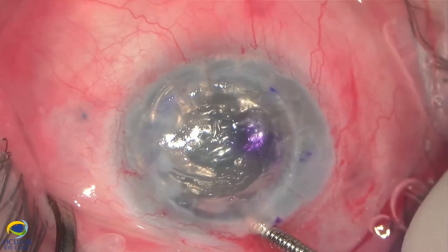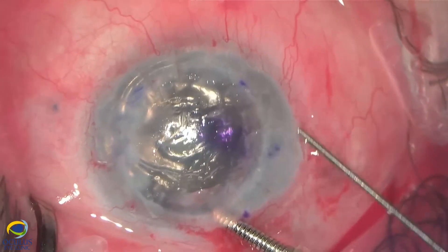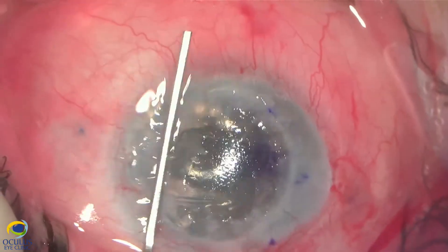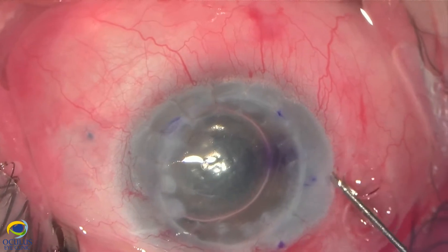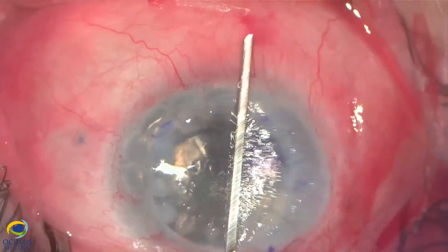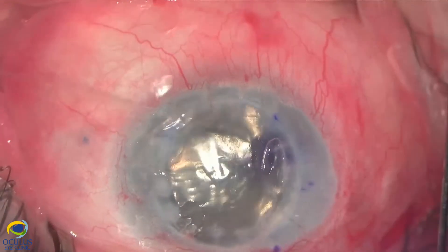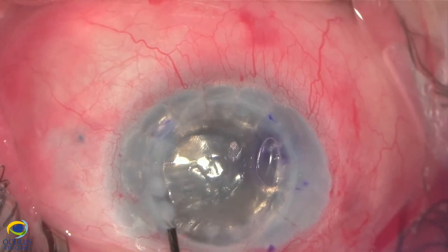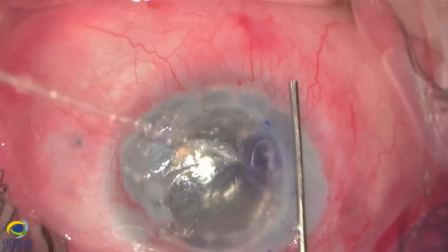In cases like this, it is quite difficult to see the margins and limits of the graft in order to center it, because the host part is quite white and opaque, and the host-graft junction as well. So I need to inject air once or twice in order to see the limit of the graft and to center it better with gentle massage manoeuvres.